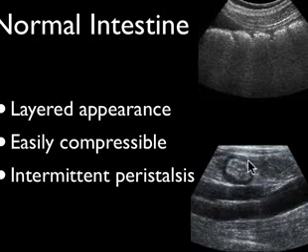And in a short axis, between peristalsis, this is normal bowel here, seen in a short axis. When it's in the middle of peristalsis, all the air gets kind of pushed aside, and we see the actual rugae of the bowel. And that's what normal bowel looks like in a normal patient. These are blood vessels down here, and this is, again, what normal intestine looks like up here.